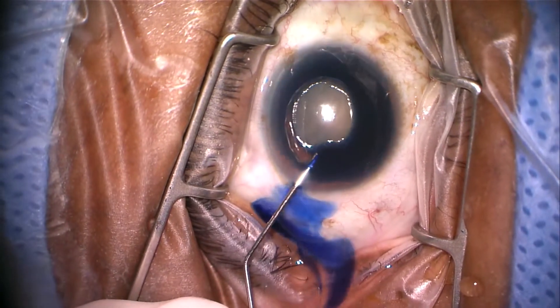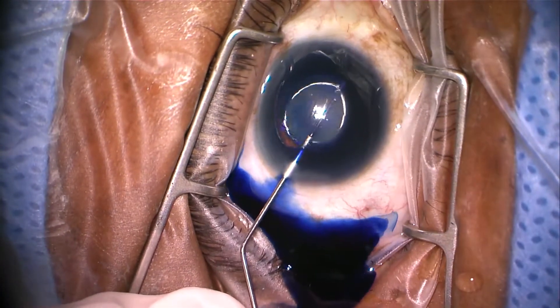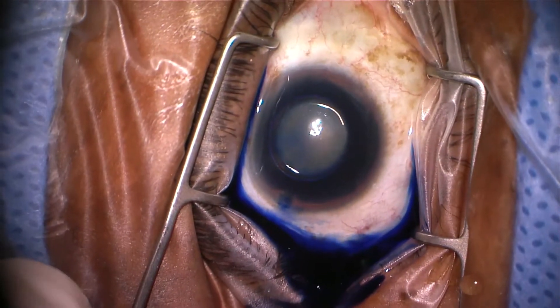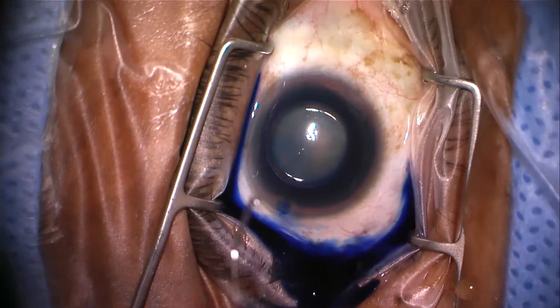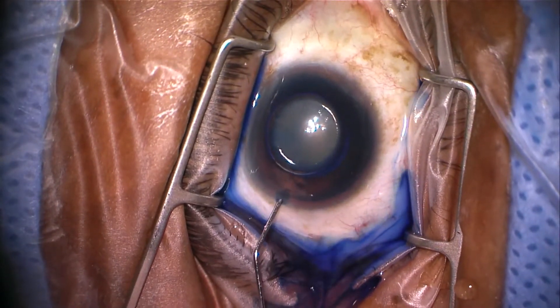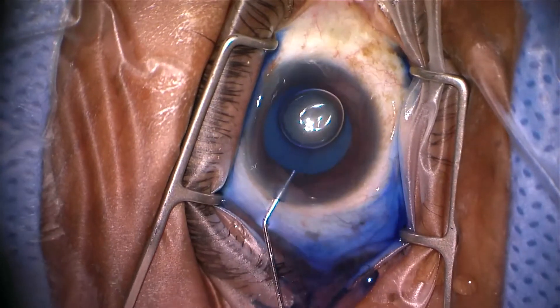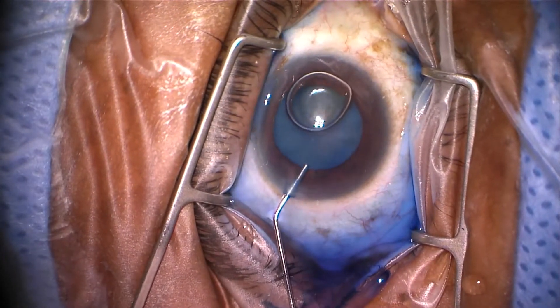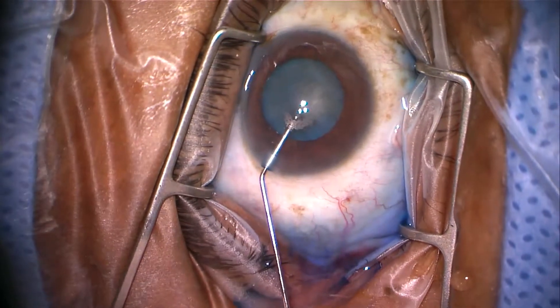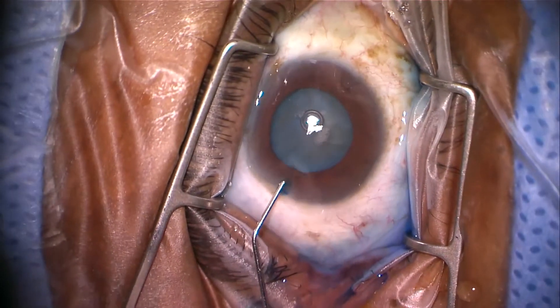So here comes the air. I don't usually use air when I put TriPan in — I don't find that it's necessary, though other folks will emphasize that it works well for them. The most important part is to make sure that the capsule is completely covered with TriPan so that you don't have any margins that you can't detect. There's going to be a blush of air bubbles — I think those come from the paracentesis, from a video I saw at Ascaris some years ago.